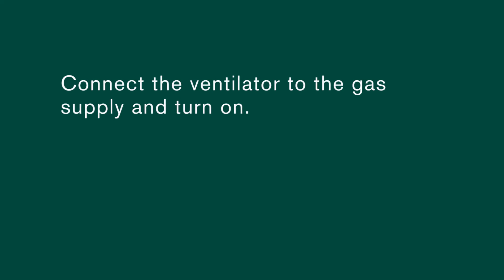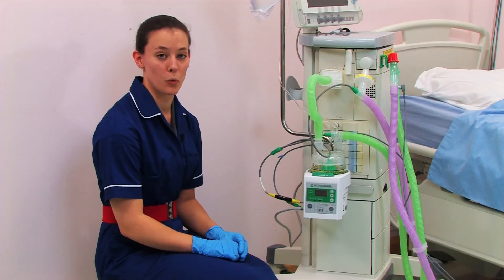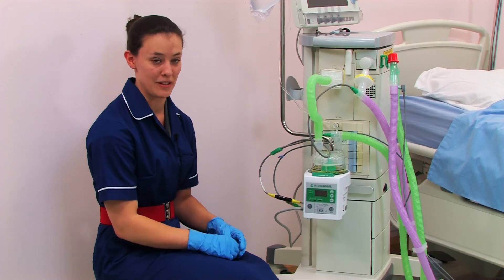Connect the ventilator to the gas supply and turn on. Carry out the pressure testing applicable to the ventilator protocol. Ensure there's enough water in the chamber, then turn on the humidifier.